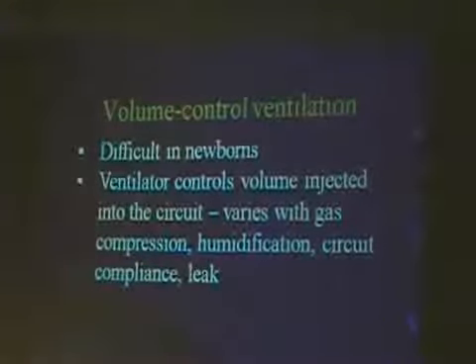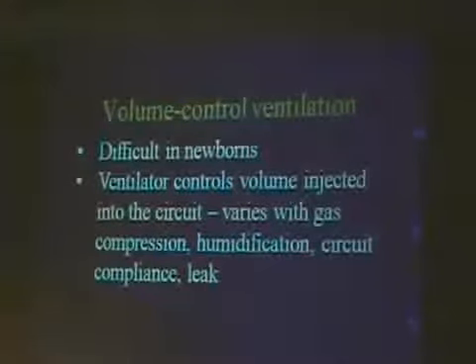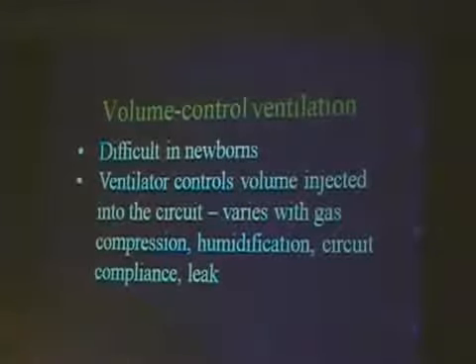It's done successfully in pediatrics and adults. In fact, that's the predominant way that kids and adults are ventilated. It's more difficult because of the smaller volumes in the newborn. It's not impossible. Some people in the field do use it occasionally, and some people really like that mode. But in general, it's more difficult to do, more difficult to control, and it requires a lot of recalibration, sometimes as much as hourly, to make sure that you're doing the right thing and giving the right volume.